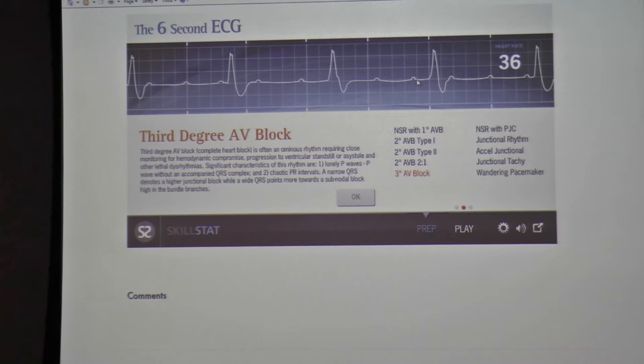So you're always worried that it'll just stop and have P waves going across the screen with no QRSs and be dead. And the other thing would be the rate. So this is, I would say, slow. 36 is below 40, so I would call it slow. And it has wide QRSs, so this is probably somebody that they're going to pretty much whisk in to get a pacemaker.